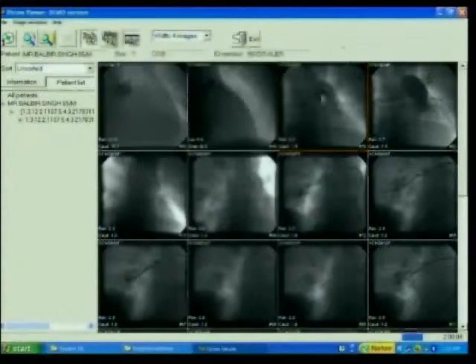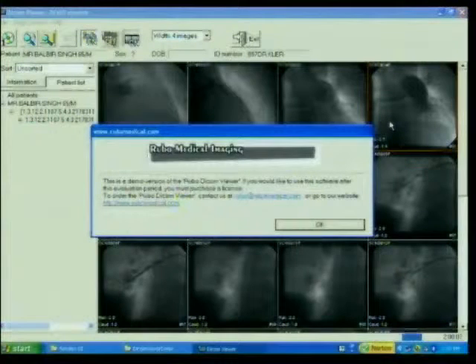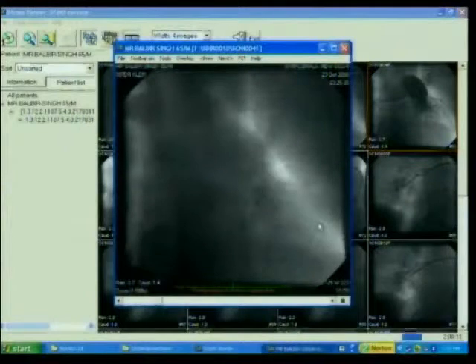Okay. So this is a patient with massive pulmonary embolism. Patient presented with deep vein thrombosis and cardiogenic shock. Because the patient was in severe hypotension, cardiogenic shock, there was no other way to tackle this patient. This is an angiogram which shows there is a big clot in the main pulmonary artery, there is a big clot in the right pulmonary artery, and the left pulmonary artery we can hardly see. Next.